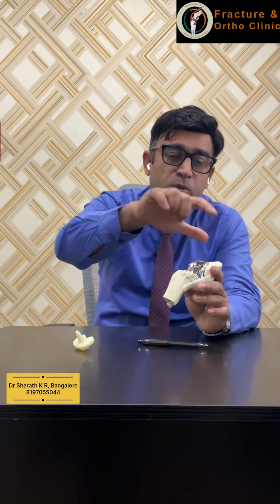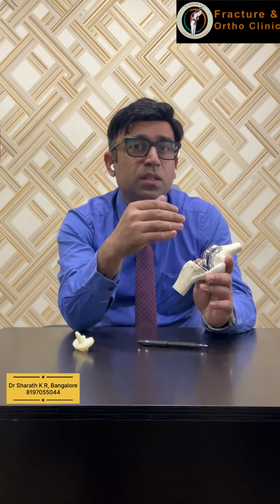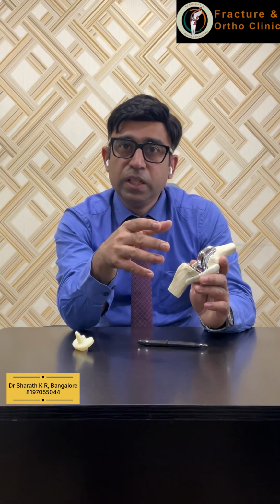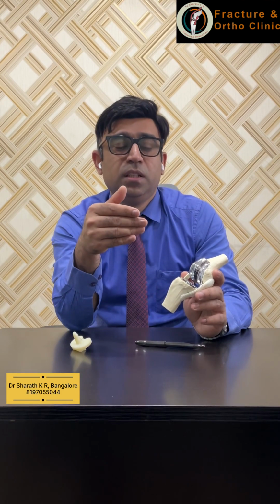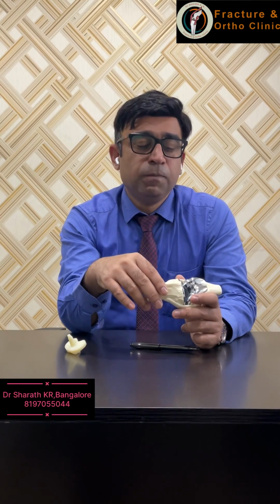Another feature which is important in the MAKO robotic system is that there is something called a haptic boundary. It will create a boundary so that whatever resection we are doing will not cross the boundary, so that soft tissue damage or damage to the vital structures is absolutely nil. So based on these features, we can do surgery, something like a personalized surgery, because we are fine tuning this resection to the extent of 1 degree, 1 mm in all these planes to make this knee as natural as possible.